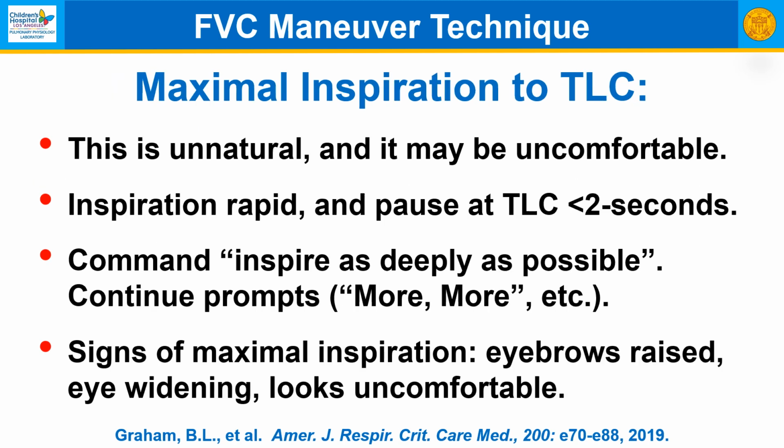For the maximal inspiration, note that this is unnatural and it may be uncomfortable. The inspiration should be rapid and pause at total lung capacity for less than 2 seconds. The command is "inspire as deeply as possible," with continued prompts like "more, keep going," etc. And signs of maximal inspiration: sometimes the eyebrows are raised, there's eye widening, and the subject looks uncomfortable. This is not a natural sort of thing that most people do most of the time. So it should look like this is a little bit of a unique experience.